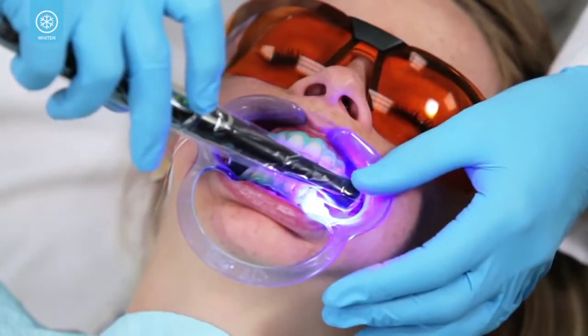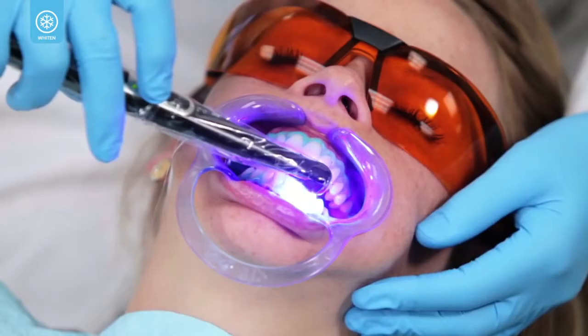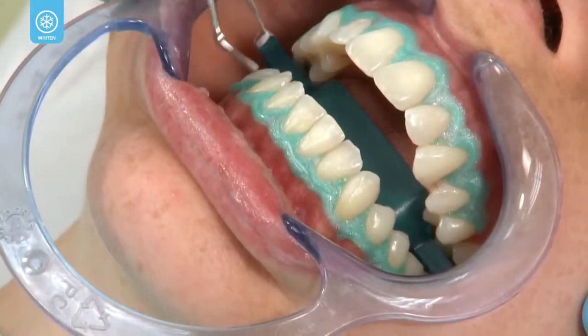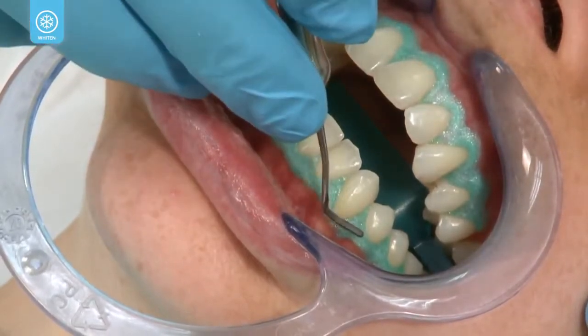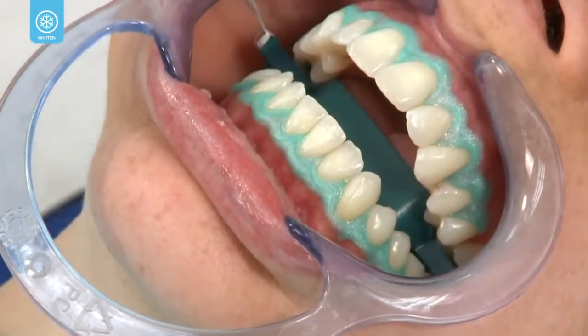Light cure the resin for 20 seconds per arch using a scanning motion. Carefully check the resin cure with an instrument. With the resin barrier cured, you're ready to apply Opalescence Boost to the prepared teeth.